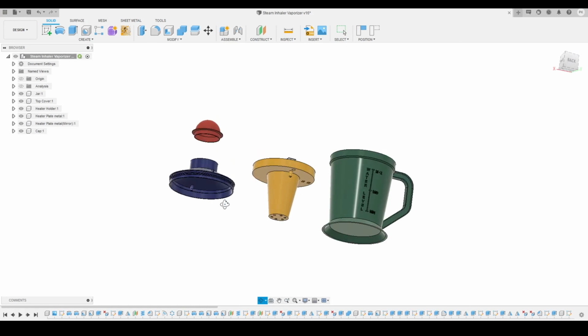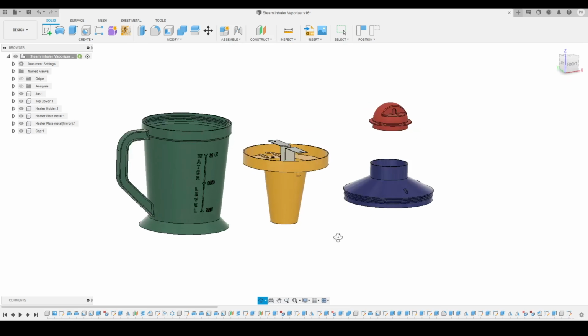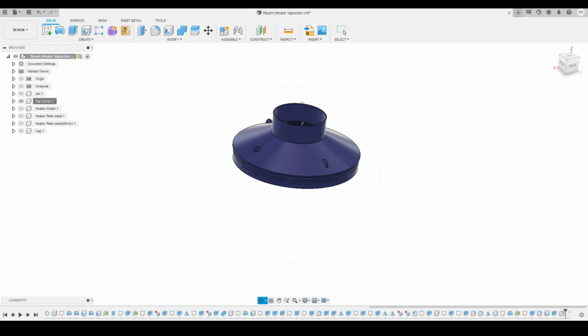This video is tutorial part 2 of our steam inhaler vaporizer 3D modeling inside Autodesk Fusion 360. And in this video we are going to model the top cover part in Fusion 360. We are going to use some reference measurements from the jar components.